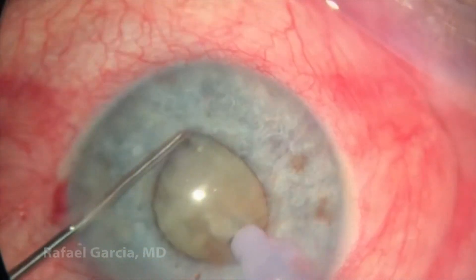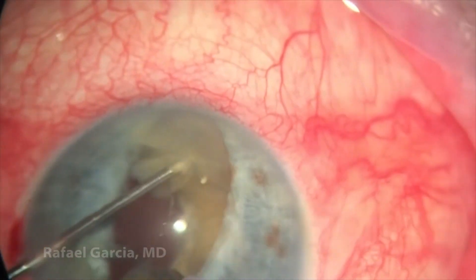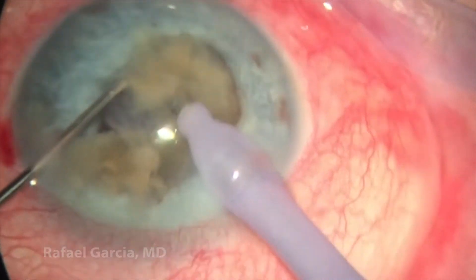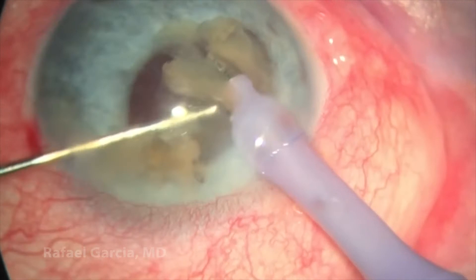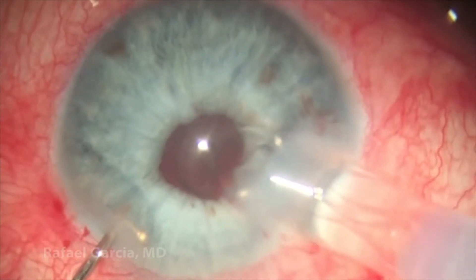So here we try a phaco chop technique through this small pupil. The dense nucleus is brought up more anteriorly and we split it in two halves. It's definitely a little bit of a challenge to chop and emulsify this dense cataract, but we eventually make it through and the last piece is taken down here.